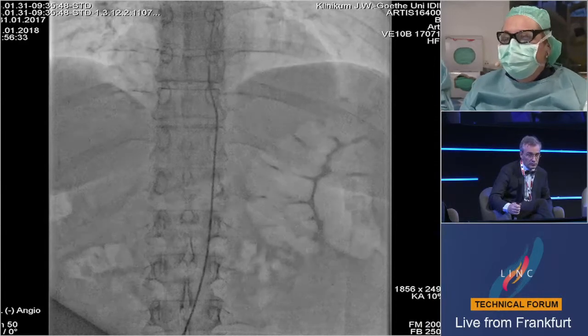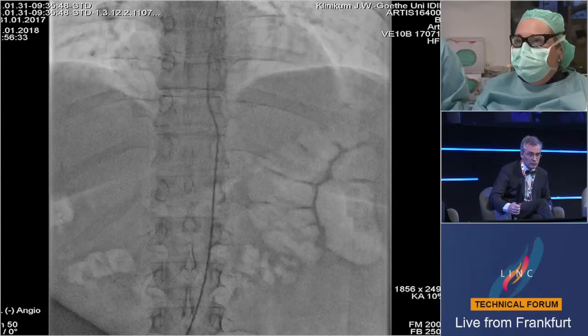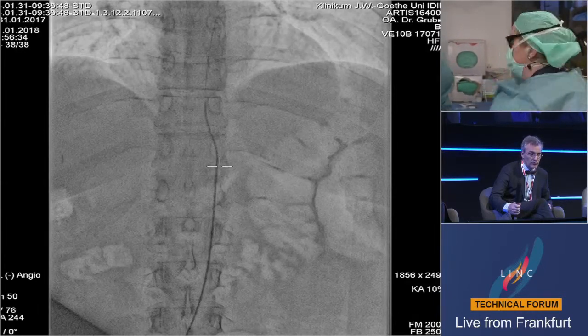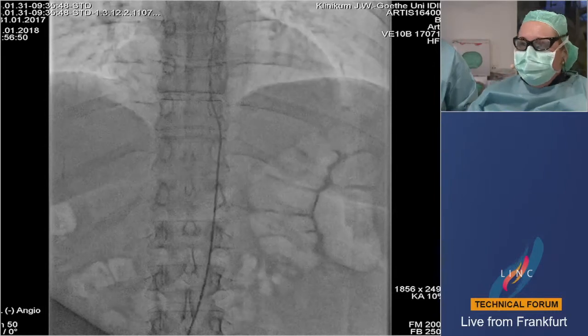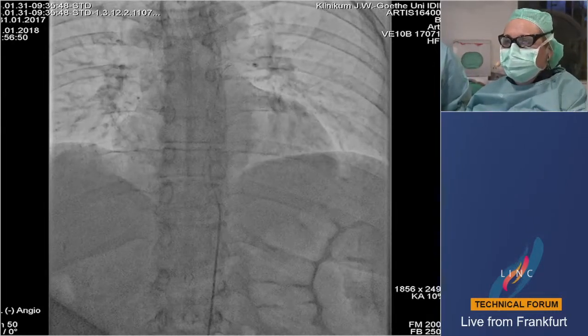In the arterial phase of the MRI from December 2017, we can see 3 liver lesions in liver segments 8, 5, and 6.